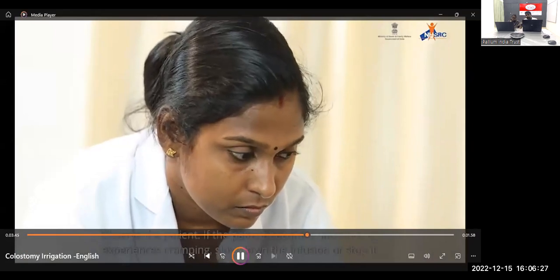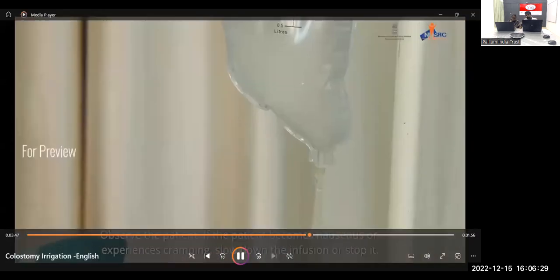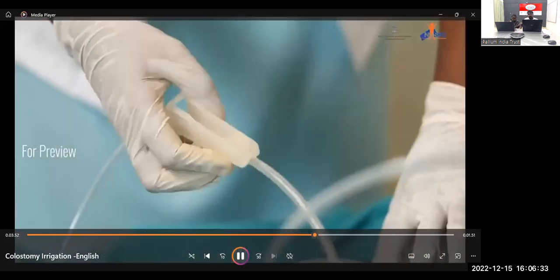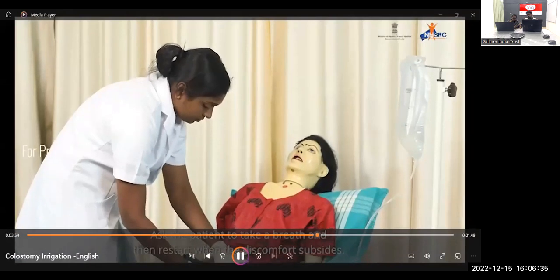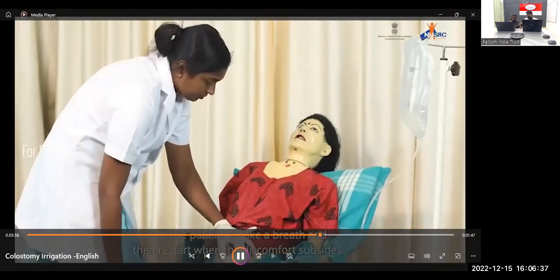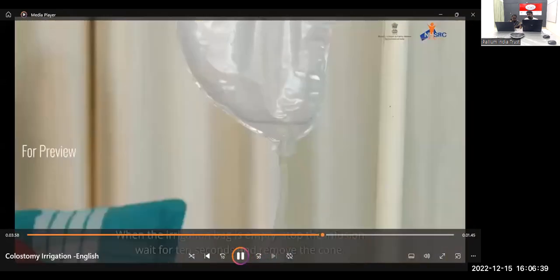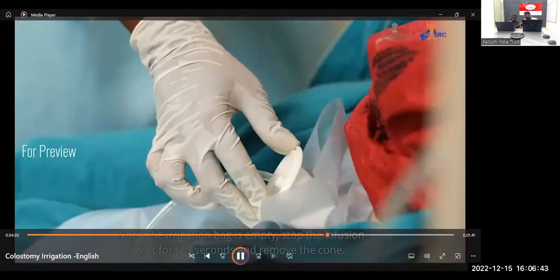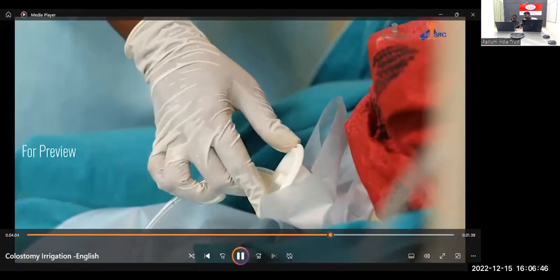Observe the patient. If the patient becomes nauseous or experiences cramping, slow down the infusion or stop it. Ask the patient to take a breath and then restart when the discomfort subsides. When the irrigation bag is empty, stop the infusion, wait for 10 seconds and remove the cone.